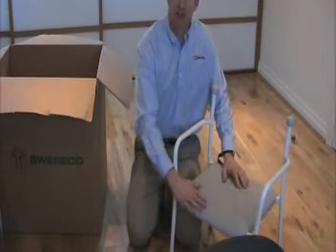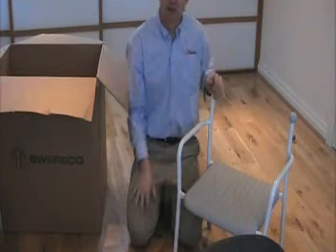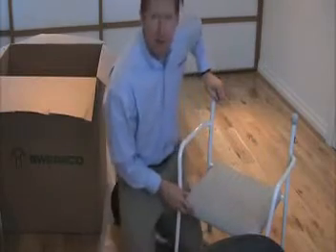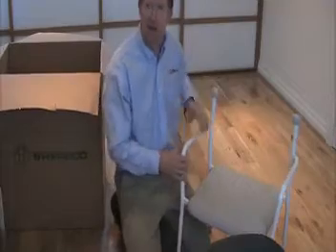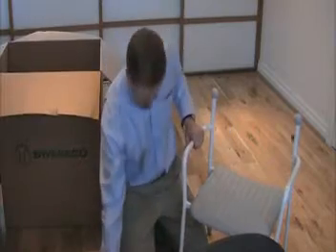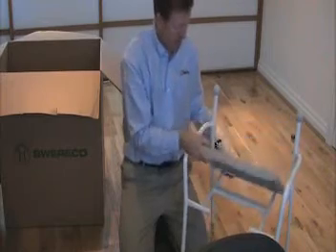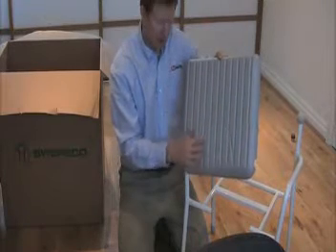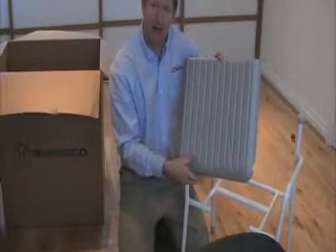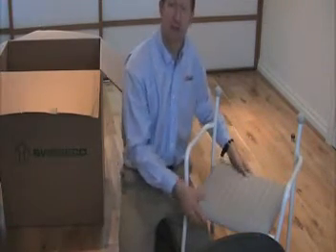On this shower chair, it comes without the backrest. There are two backrest options: a soft material that goes across the back, or a plastic backrest. I'll show you how this works in a minute. The seat on this model is the full seat. There's also a cutout version which has a section cut out for easy cleaning and access.